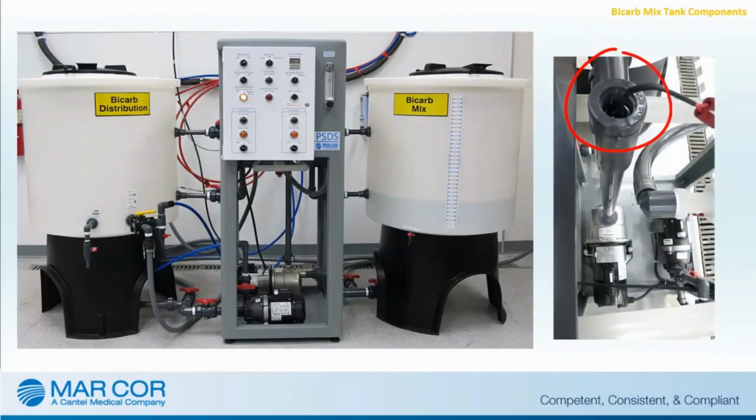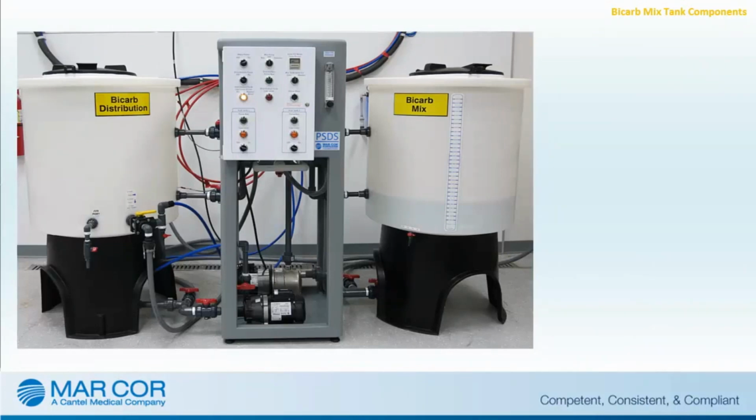A flow switch is located on the output side of the mix pump. The flow switch prevents damage to the mix pump by automatically turning the mix pump off during insufficient flow situations. An audible alarm will also sound.